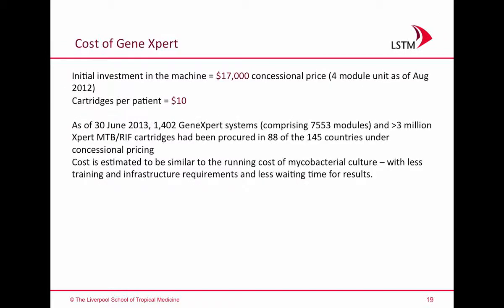There are some caveats. The GeneXpert machine, a 4-module unit, costs $17,000, and the cartridges have just been reduced from $17 to $10 per cartridge, which are single-use, one patient only. But there is huge enthusiasm for GeneXpert.